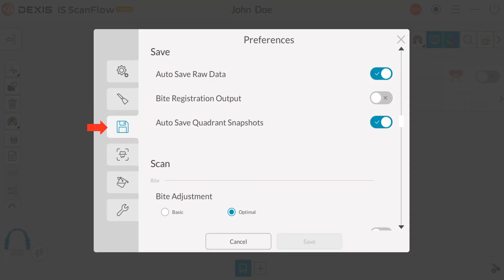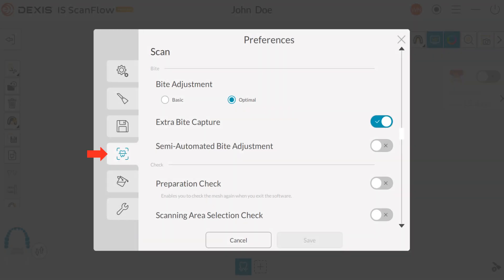Under the Save tab: Auto Save Quadrant Snapshots — toggle on or off. Enabling this feature automatically saves quadrant snapshots in JPEG format for every scan period. Under the Scan tab: toggle Extra Bite Capture on or off — enable it if there are cases in which more than one bite registration is required. Examples could be protrusive, centric relation, or open bite.